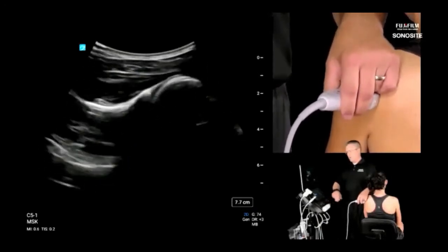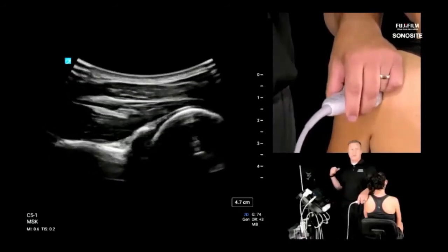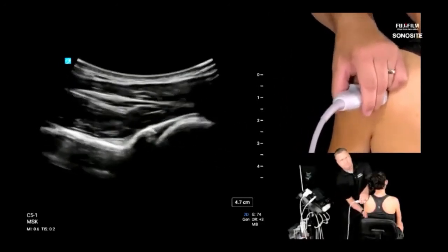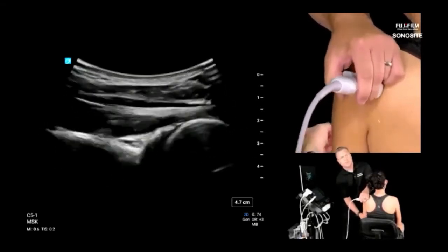So, anyways, have a curvilinear handy. If you're seeing shoulders bigger than mine, have a curvilinear handy. You'll really thank yourself. Okay, I know we're really short on time, and we did have a couple of questions pop in, so let's see if I can get through all of these. Yeah, we got 5 minutes.